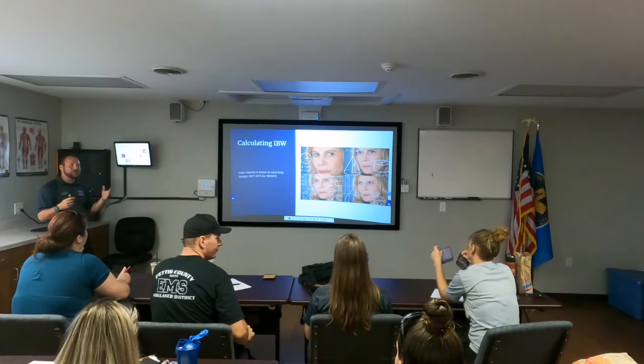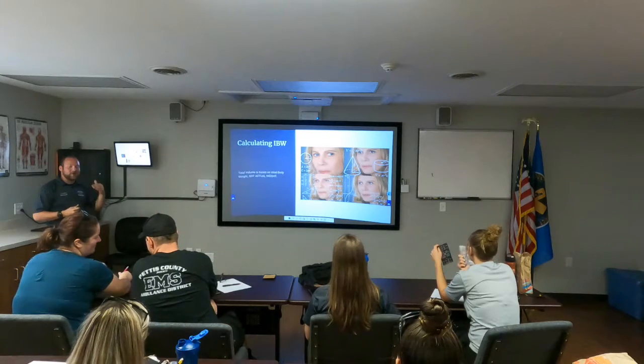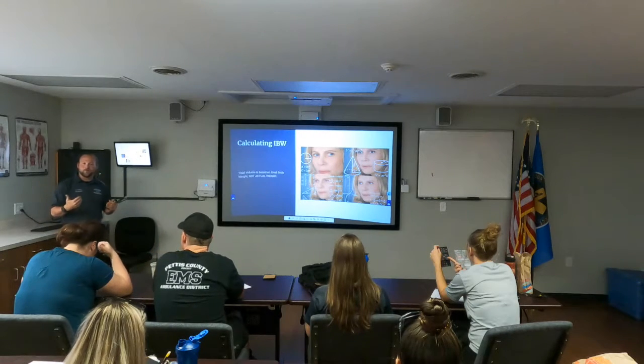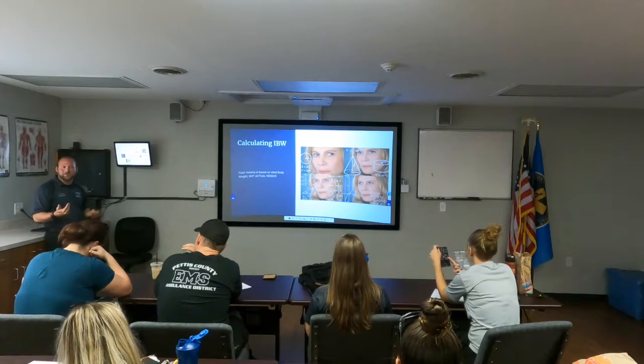That card, if you look through it, is going to give you the down and dirty on the best ways to initiate your vent, a ballpark way of at least setting it up. It will give you your ideal body weight for both male and female from 5 feet all the way up to 6.5, if I remember correctly.